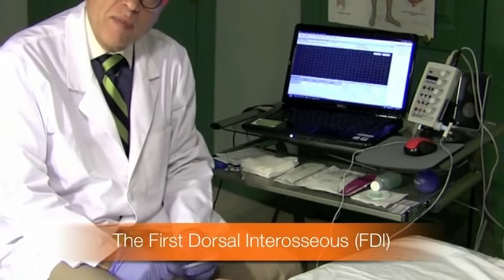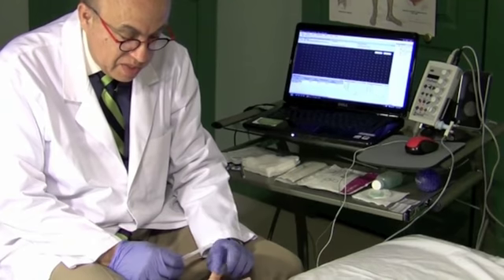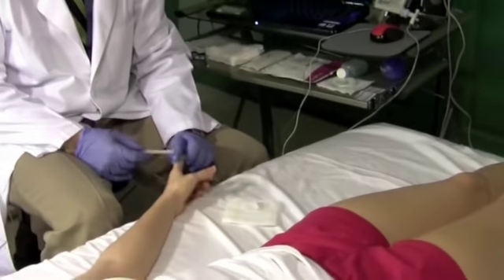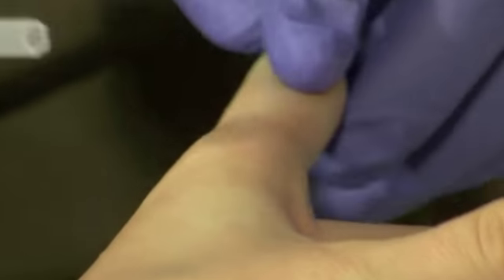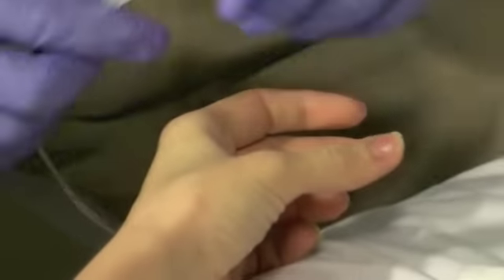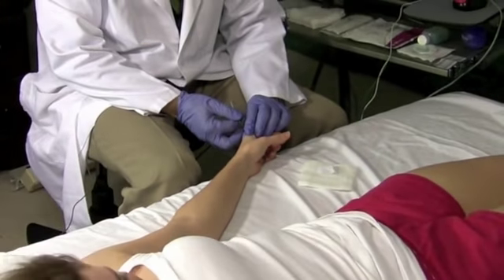So let's go for the first muscle, the first dorsal interosseous muscle, which is really the muscle that lifts this index finger up. Lift the index finger up, point it to the ceiling. It bumps up here, okay? So right now, put your finger down, relax. And I'm going to put this out of the way. And I'm going to go inside the muscle.